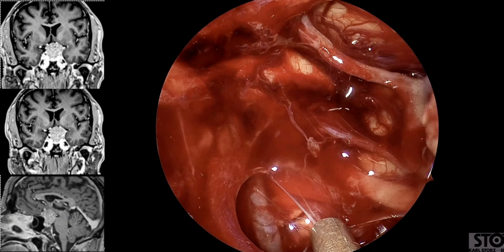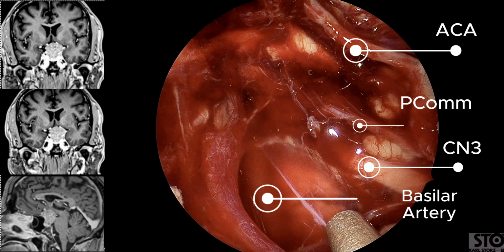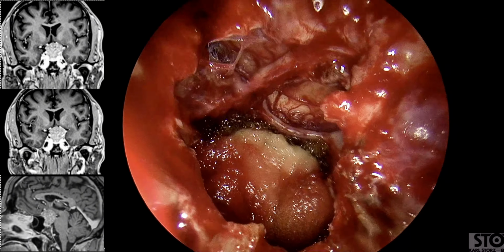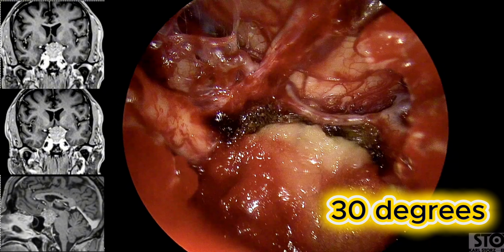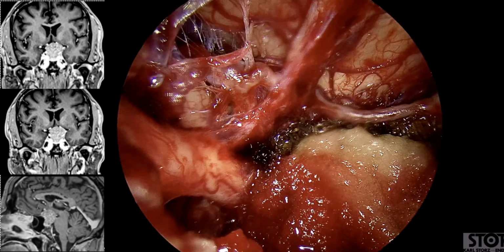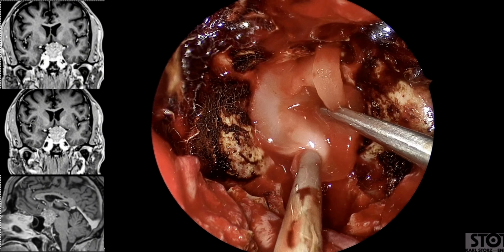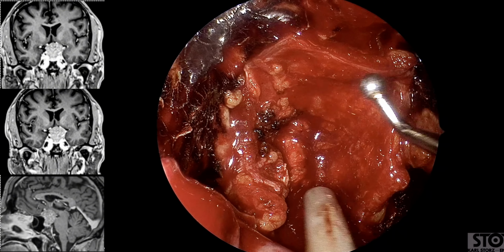At the end of the resection, we confirm complete tumor removal and preservation of all critical neurovascular structures. A 30-degree endoscope is used to inspect the cavity and ensure no residual tumor remains. All perforators are preserved. Reconstruction is performed using a multilayer technique, including inlay dural substitute, fascia lata, and a vascularized nasoseptal flap.